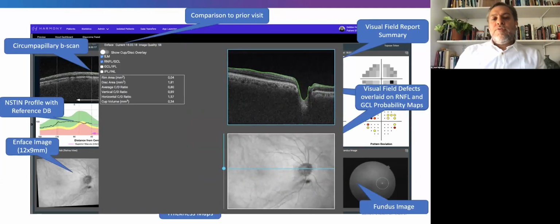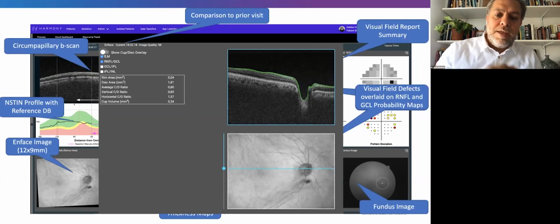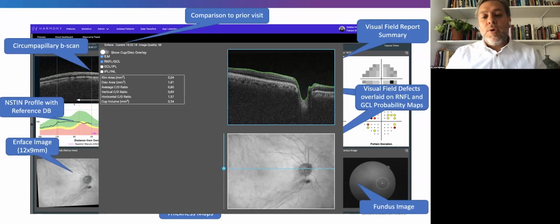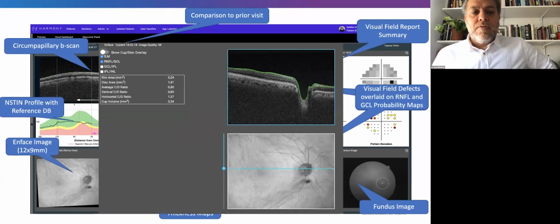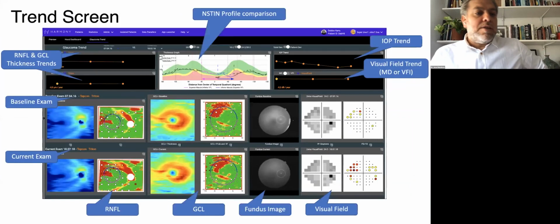This is how we could start repositioning the macula or the B scan, so we could flicker from this switch and place it in the correct position, as we're talking about, to avoid the different types of images that are not correct. This is the trend analysis view.